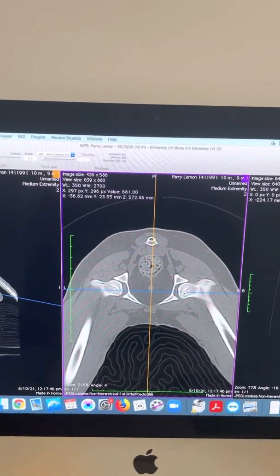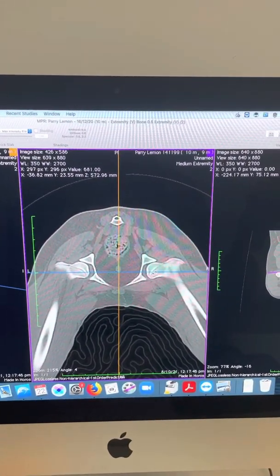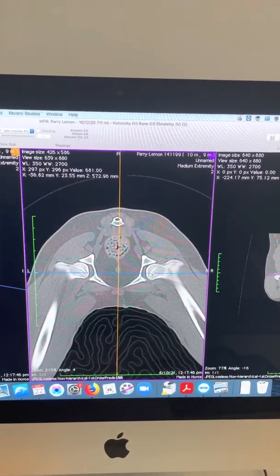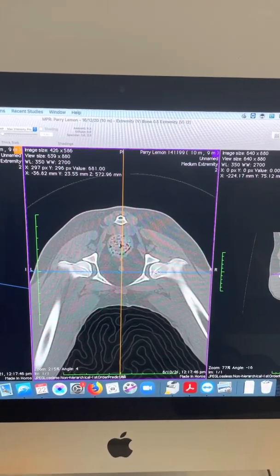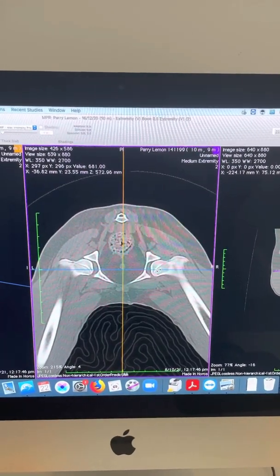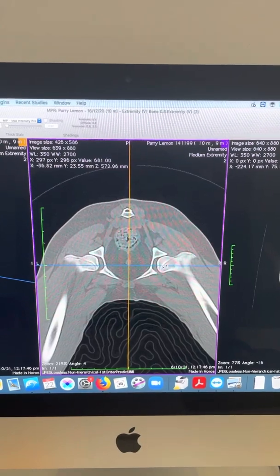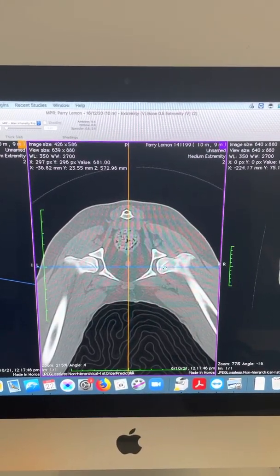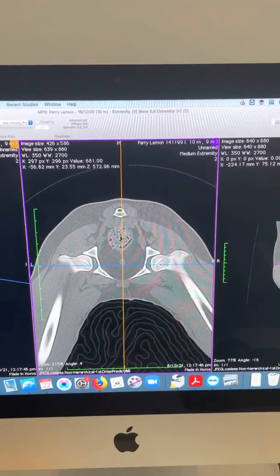To recap: age less than 12 months; they're generally going to present with a lameness; they'll have a positive Ortolani sign on palpation. We then look at imaging — you can do some of this on x-ray but CT scan is more sensitive. We're looking for any degree of arthritis, and we're looking to see if there's any blunting of the dorsal acetabular rim. We then measure the dorsal acetabular rim angle to determine what size plate to use, and we check the distraction index is less than 0.7.